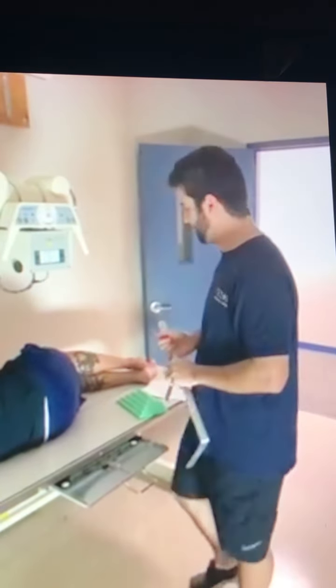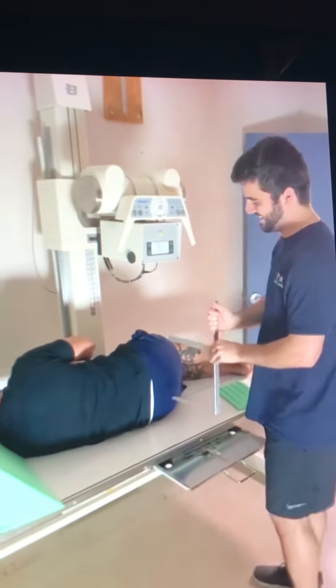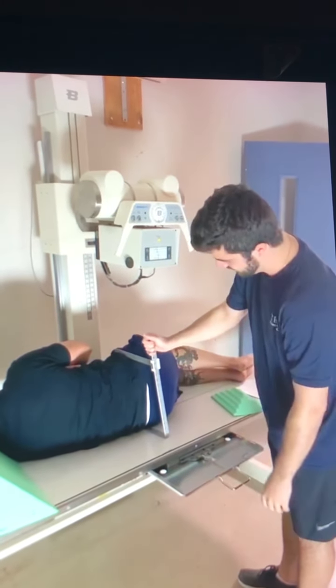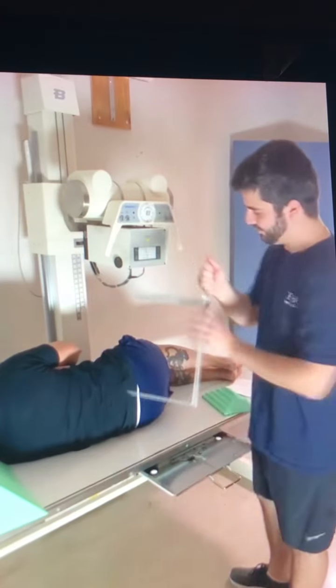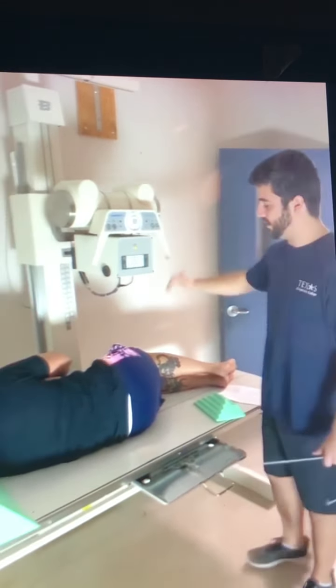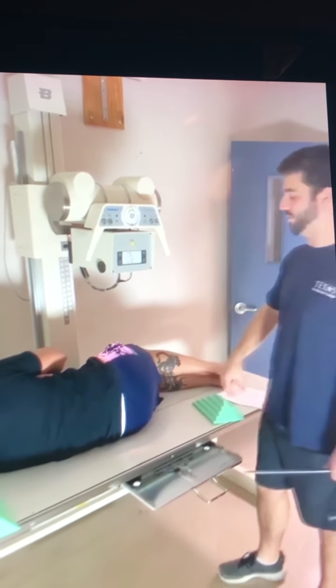Alright, so now you want to do lateral coccyx. Perform lateral coccyx. This next view is the lateral coccyx view. Almost done. So we'll be measuring. So you measure it. Marker, you want to be in the light. His left side's down, so I put a left marker.